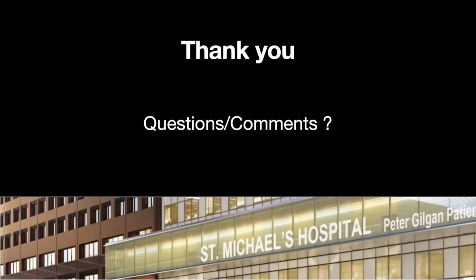So you mentioned that CT will give you a number, but even on echo, you can look at a valve and see that it's heavily calcified, and that should raise alarm bells that if the valve area is not coming out that severe, it may actually be worse than what we're getting. So a comment on the amount of calcification of the valve is also helpful in helping the attending clinician decide whether this stenosis is truly severe or not.